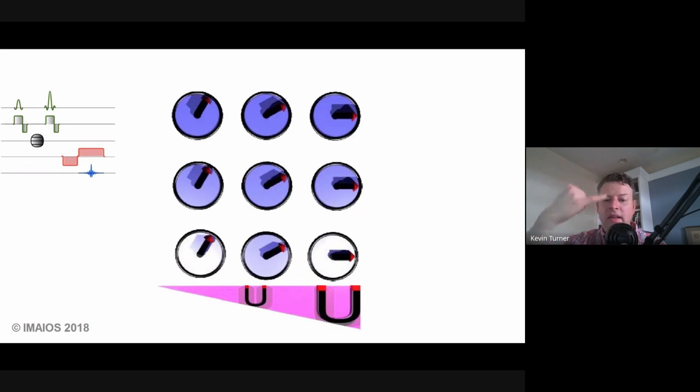Inferior to superior, lateral to medial, anterior to posterior. Three physical gradients, Z, X, Y. Those three gradients are given three jobs: slice select, phase encoding, frequency encoding. That information is encoded into the echo, decoded by the computer, and turned into the picture. So how we locate something in the body is by using these gradients to alter precessional frequency. Right. That's what we're going for here.